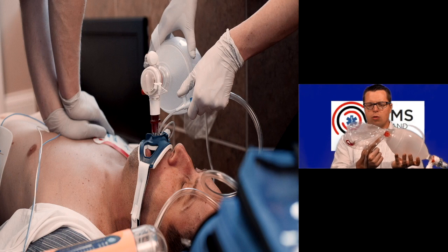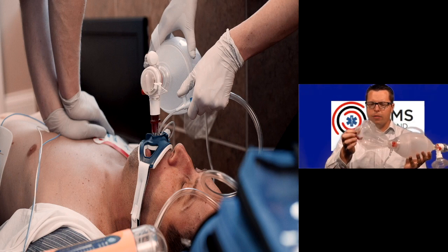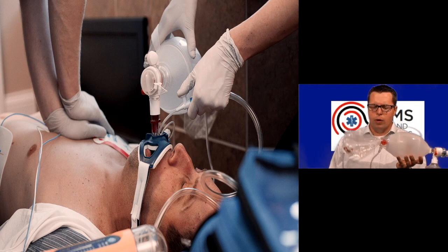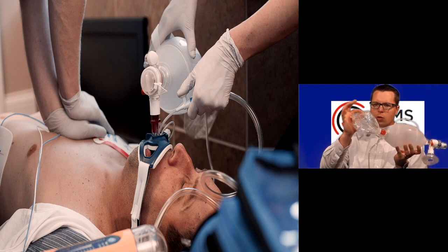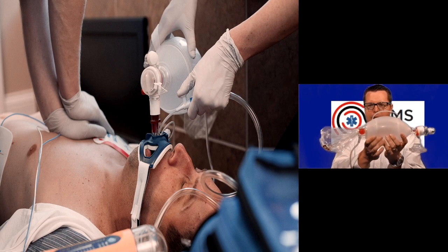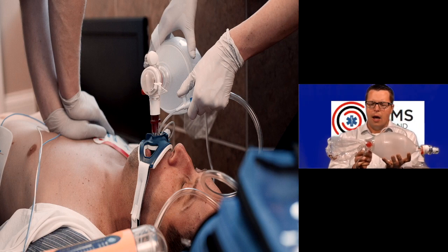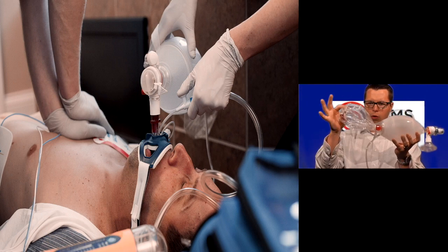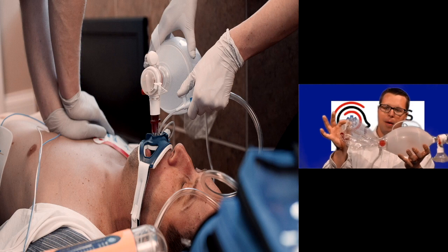That tubing flows in through a valve here and fills preferentially this bag on the back, this reservoir bag. When you put this to flowing oxygen, theoretically this is going to fill up. Now, you squeeze this bag, and when you release it, the bag by nature expands again, tries to retain its shape. When it does that, it draws air in preferentially through this reservoir bag in the back first.